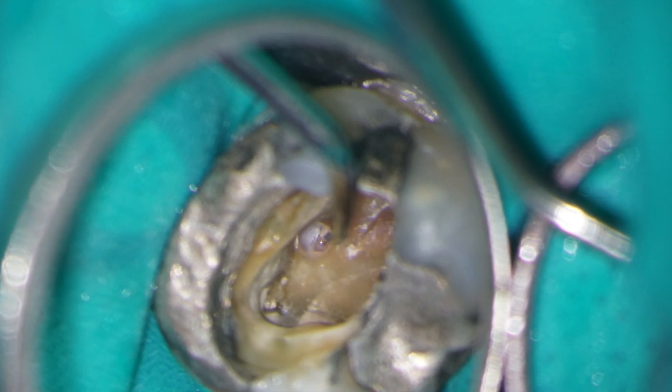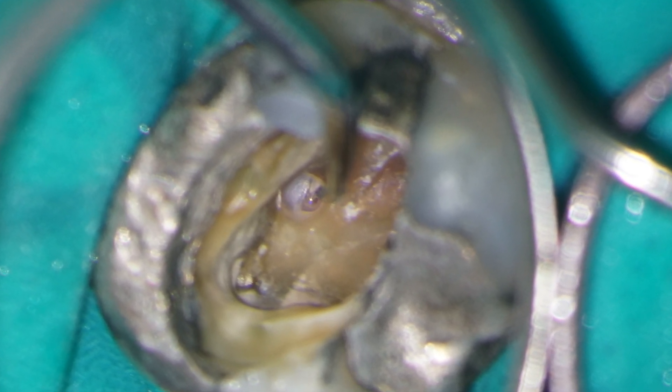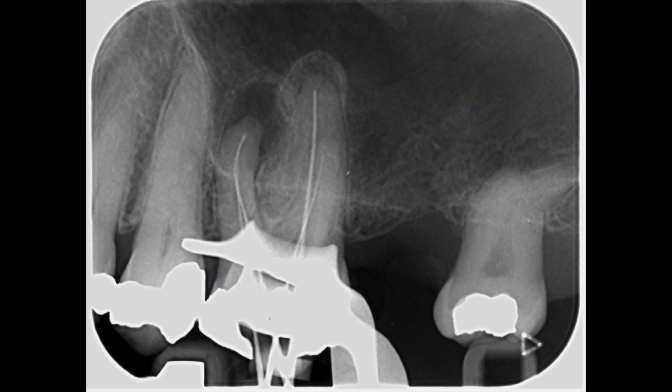Here I'm highlighting the perforation with the DG16 probe. After some preliminary coronal flaring, I can then estimate the working length using an electronic apex locator. In this case, I also exposed a diagnostic working length radiograph, just to be sure that my working lengths were correct.